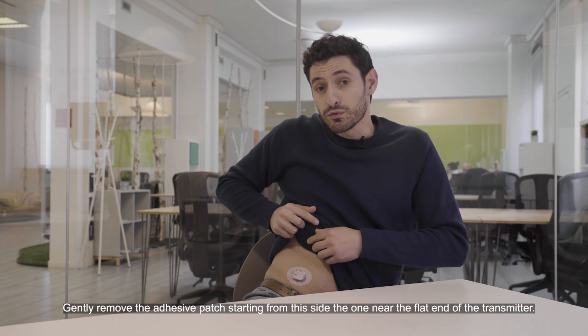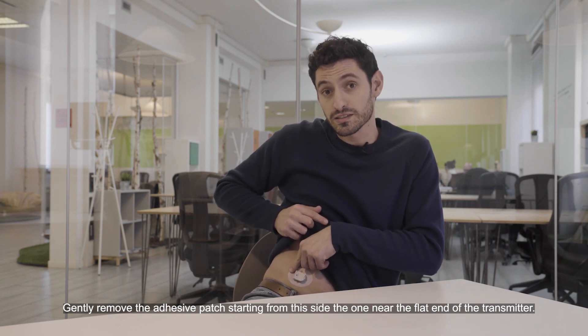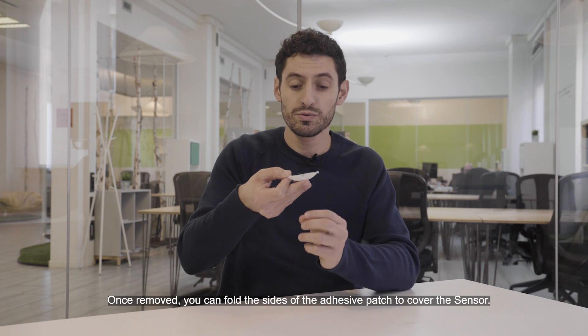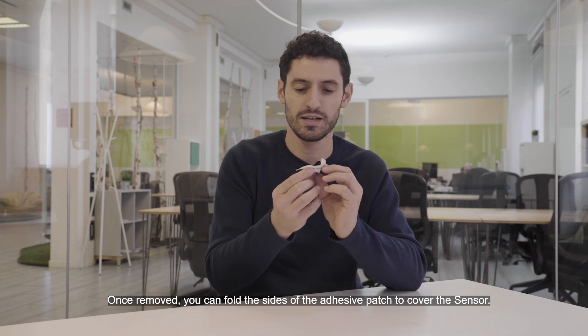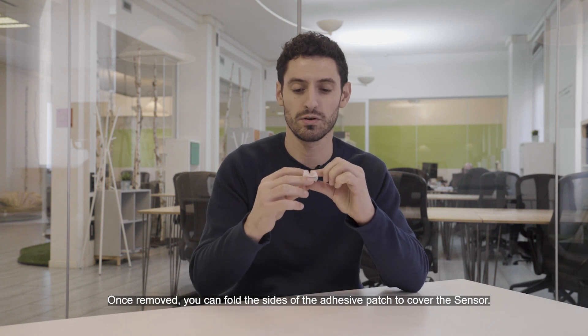Gently remove the adhesive patch starting from this side, the one near the flat end of the transmitter. Once removed, you can fold the sides of the adhesive to cover the sensor like this.